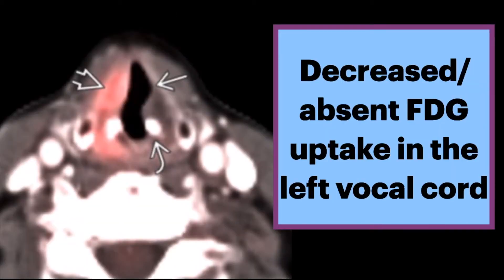Here is an axial PET/CT. The curved arrow shows anteromedial arytenoid rotation, and the straight arrow shows ballooning of the laryngeal ventricle. The open arrow shows asymmetric uptake in the normal right cord — this is not to be mistaken for a tumor, because in this case there was decreased or absent FDG uptake in the paralyzed left vocal cord.